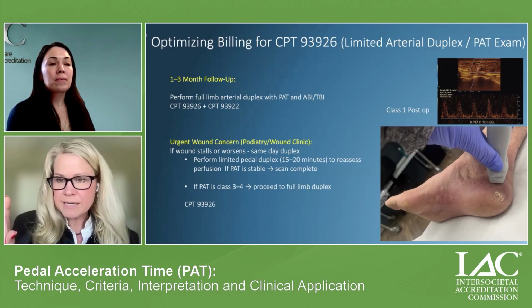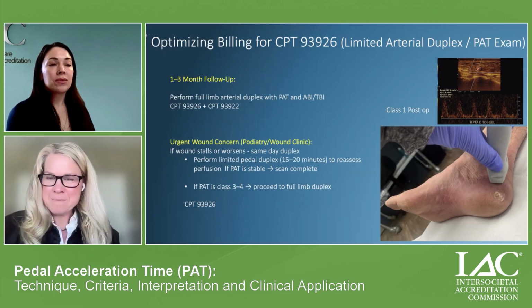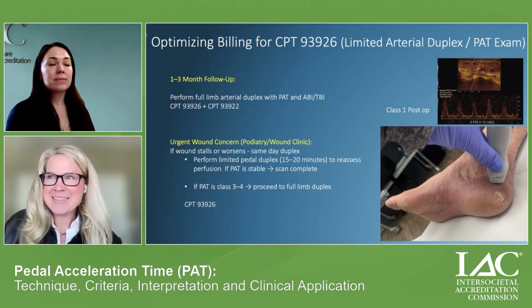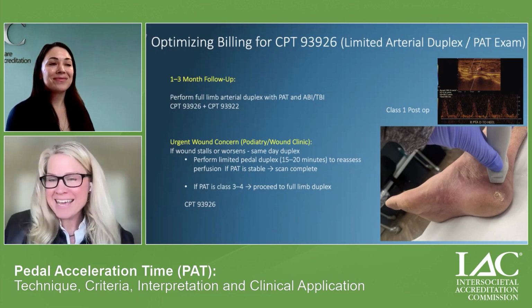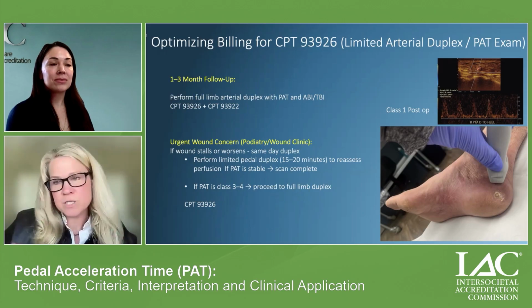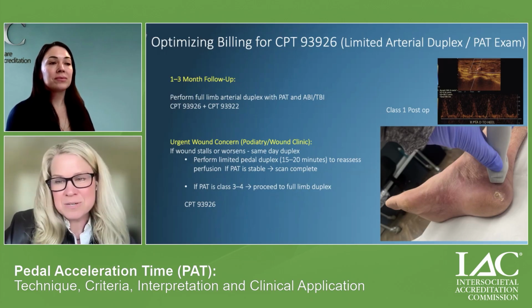So the criteria in the arterial tree does not change. And then the venous pedal acceleration time, we are working on that validation number now. So it's really evolving and becoming a really helpful metric in how we follow these patients post-operatively, because they're hard to evaluate, but we're getting there.